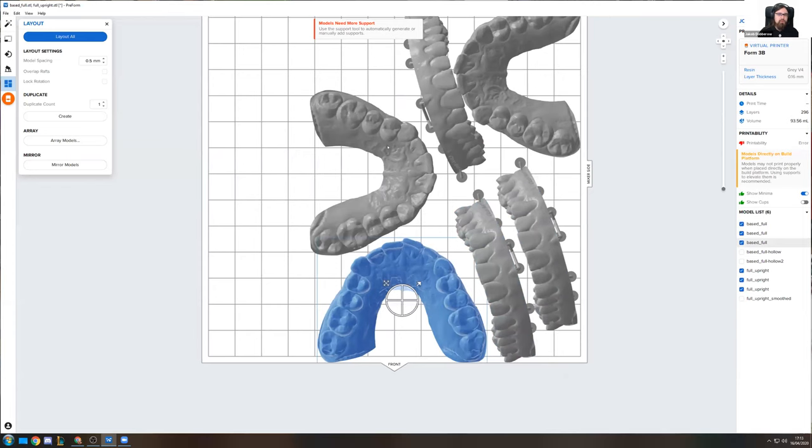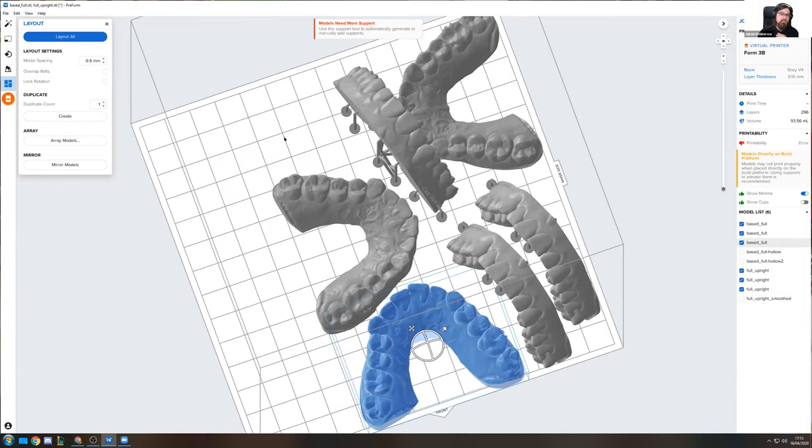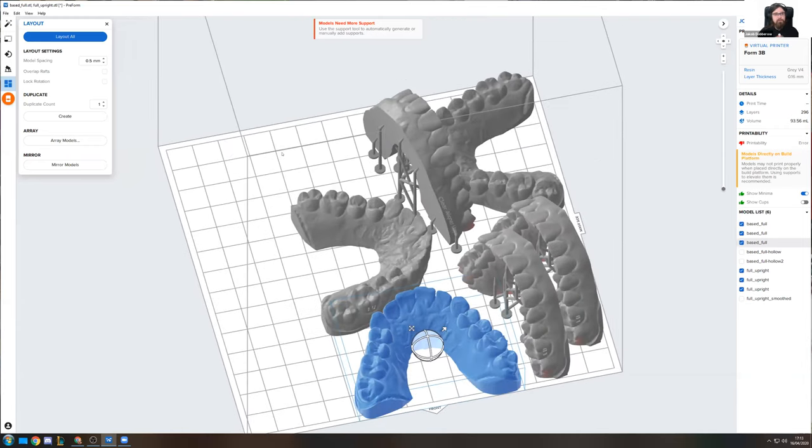But alternatively, you can click the layout all button again, and you can do this multiple times. This is true for all of these automatic functions: if you think that what it did in terms of automatic supports, for example, or automatic layout was not okay, you can give these buttons another click and have a new alternative shown. So this is how we would be using the software to orient our models.